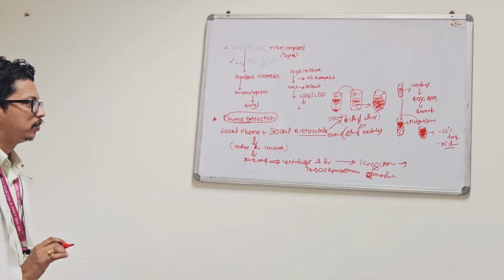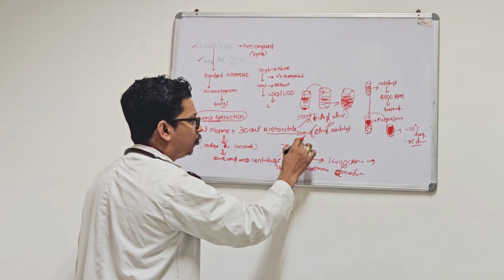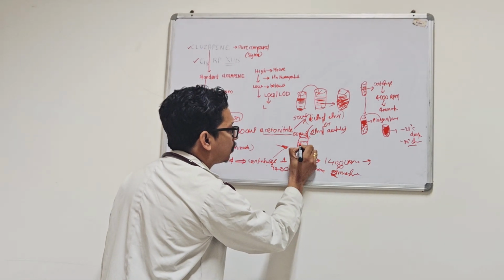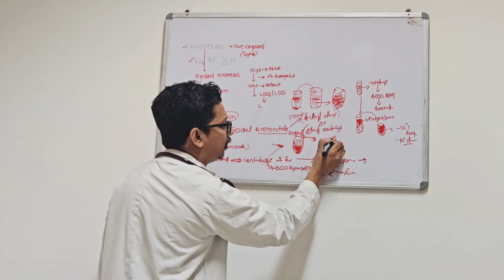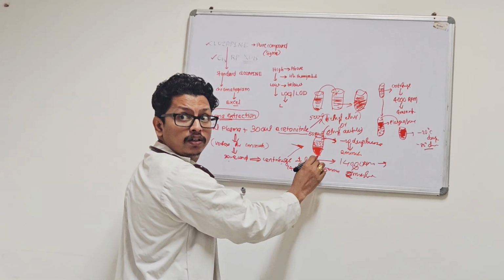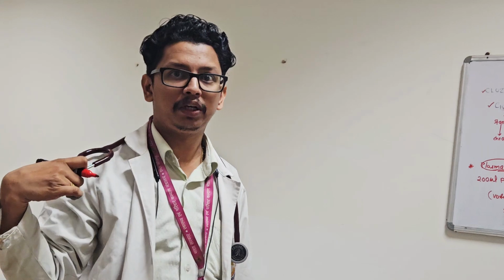Then we will get what compound. The first procedure same. vortex करना, 30 second रखना, centrifuge करना. This centrifuge करने का step के बाद you will get a like this one, 2 layer of solvent liquid. One heavy liquid, नीचे heavy liquid होगा, ऊपर light liquid होगा. उसके बाद this should be kept in -20 deep freezer for कितना time? 2 minutes. So it will be solidified. The नीचे वाला part will solidify, ऊपर वाला part will still containing the solvent with the drug, that is undissolved. Means it will become liquid only.